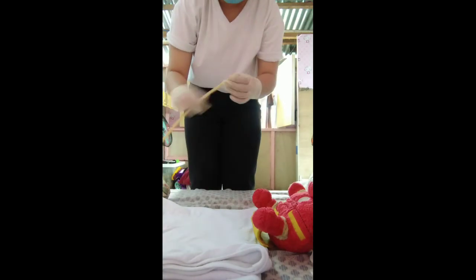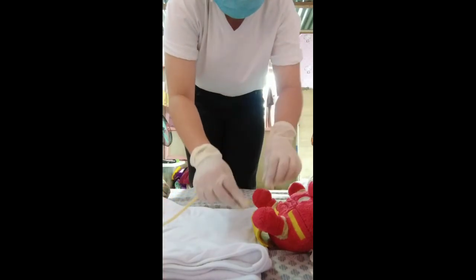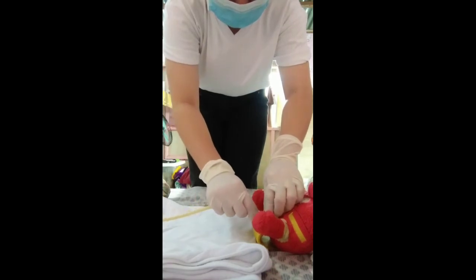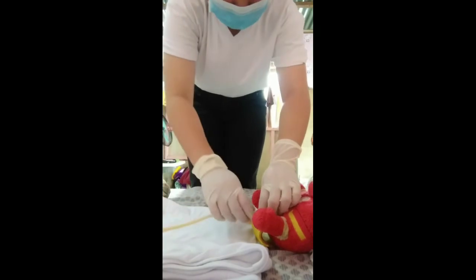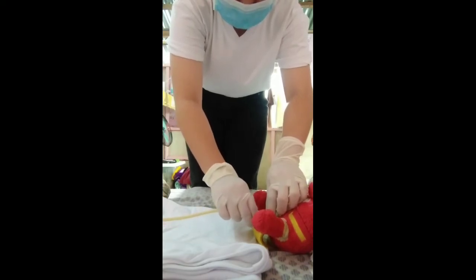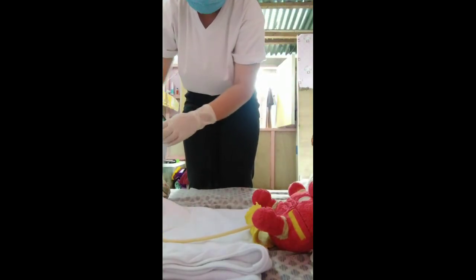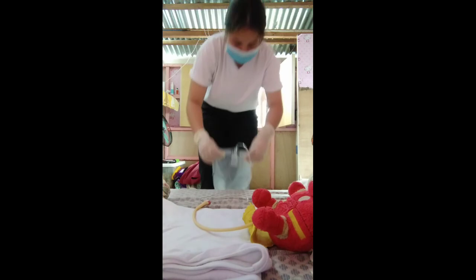So we are ready to insert the catheter into the urethral opening of the patient. So ma'am, are you ready? So 1, 2, 3, inhale, exhale. So that's perfect. Okay, so I have seen some urine in your urobag, so we need to go down 2 centimeters. So we need to go down. Okay, that's perfect. Oh, I have seen the urine in the urinary bag. So we need to put the urobag at the bedside of the patient.